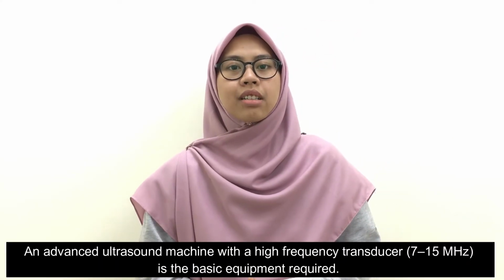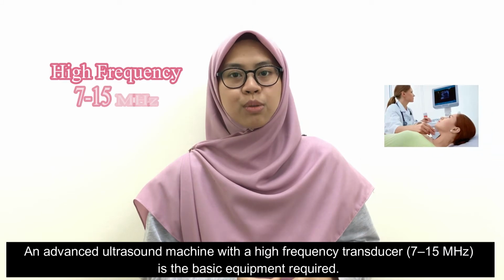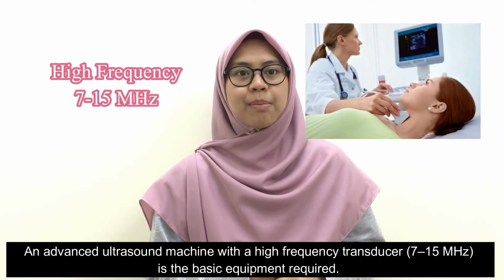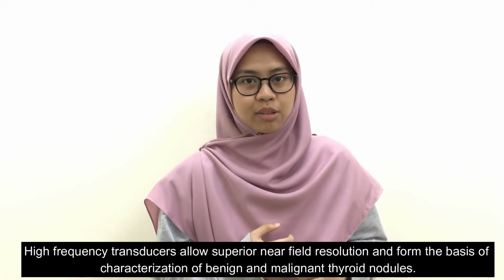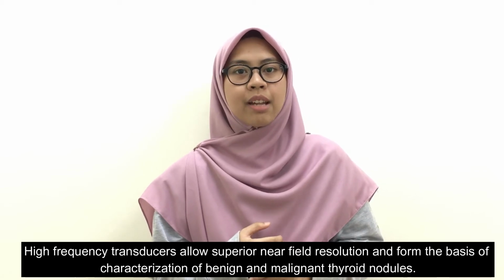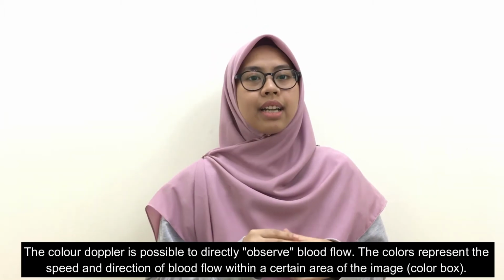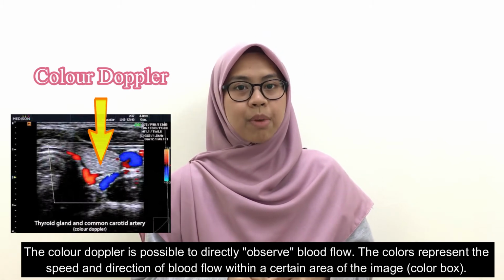An advanced ultrasound machine with a high-frequency transducer, which is 7 to 15 MHz, is the basic equipment required. A high-frequency transducer allows superior near-field resolution and forms the basis of characterization of benign and malignant thyroid nodules. With color Doppler, it is possible to directly observe blood flow.